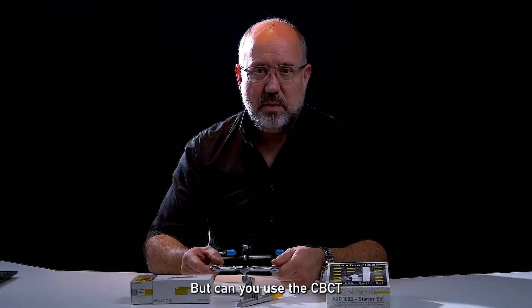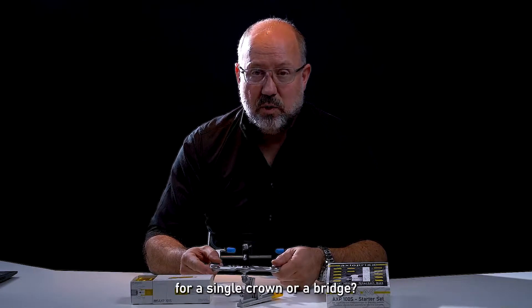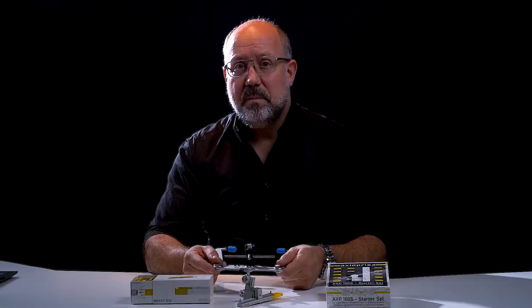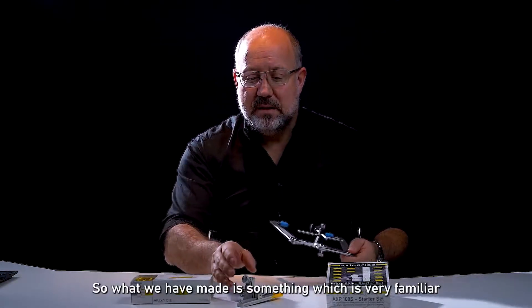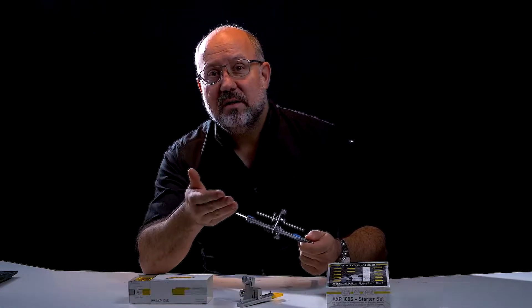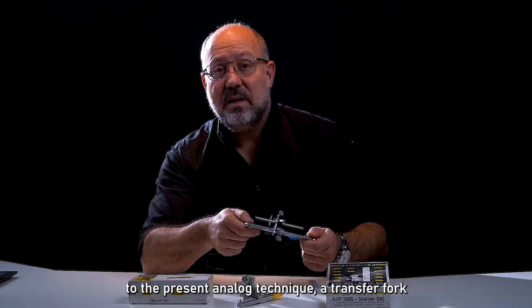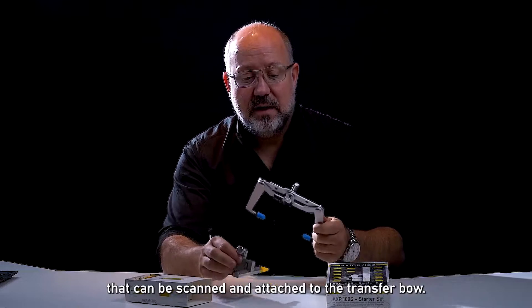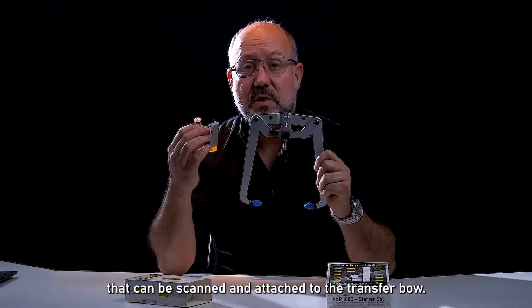But can you use the CBCT for a single crown or a bridge? Does everybody have CBCT? So what we have made is something which is very familiar to the present analog technique.